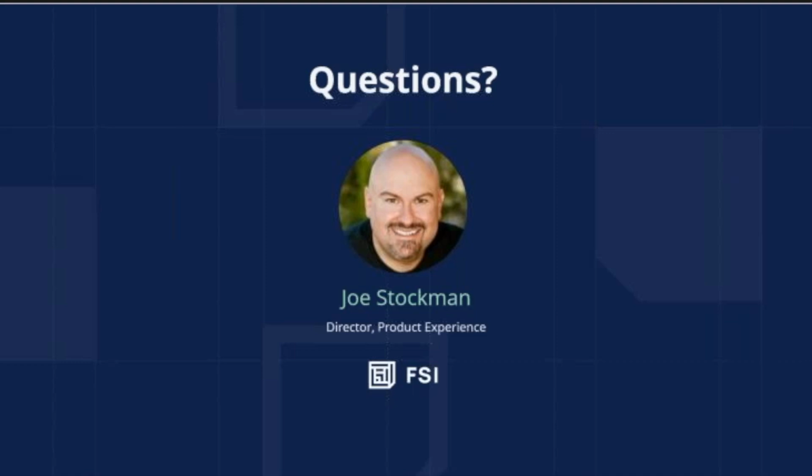If there's published industry standard data, then you could use that. So if it's new equipment and the 3 years, I don't think it's published. The 3 years is kind of just what people seem to think is good. There's no language that says new equipment has to be in service for 3 years before you can do an AEM on it. That's not there. So you're using your judgment, and 3 years of activities. As long as you have documented maintenance activity, you should be good for that.